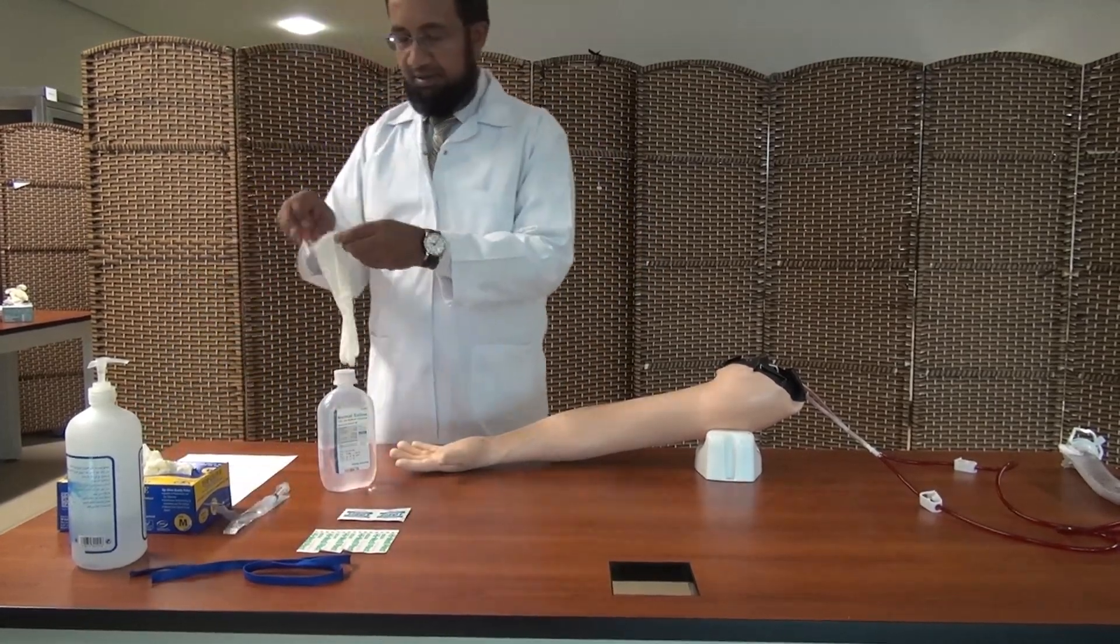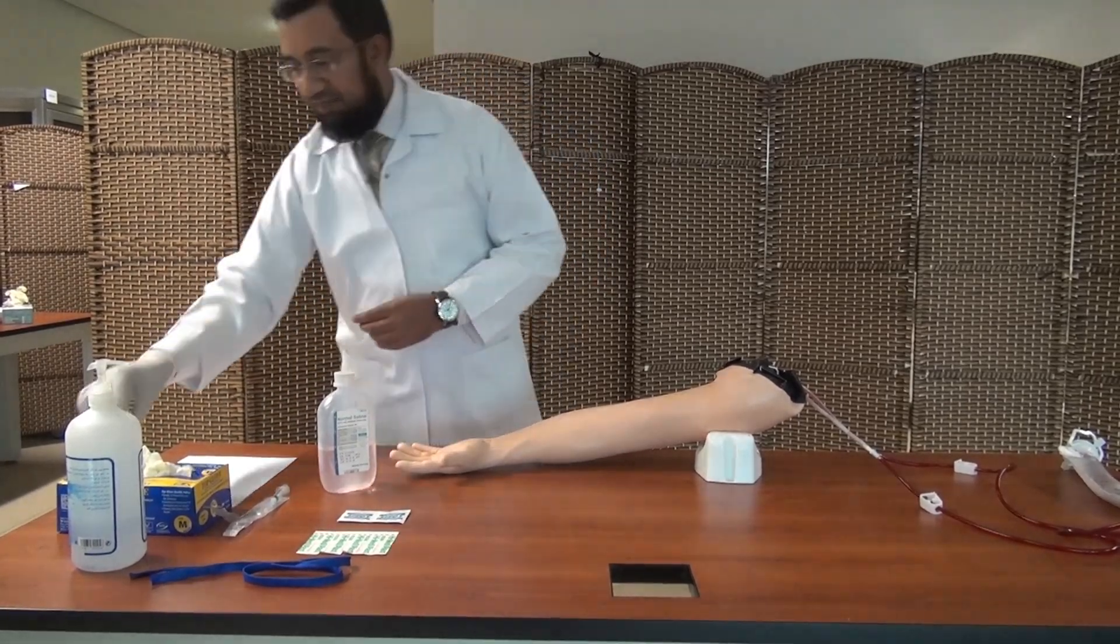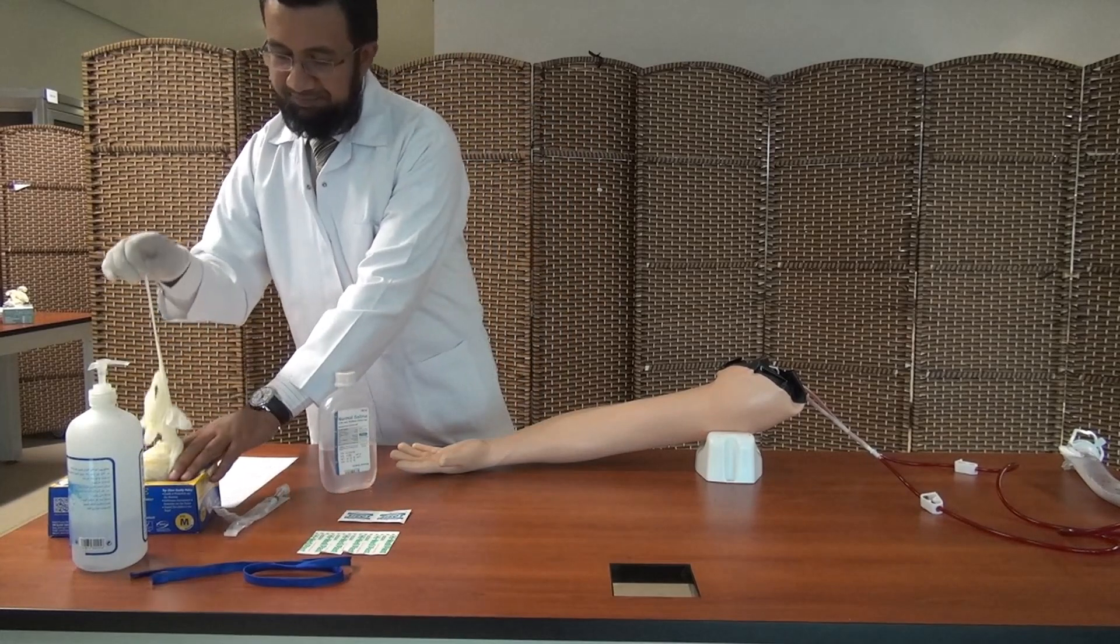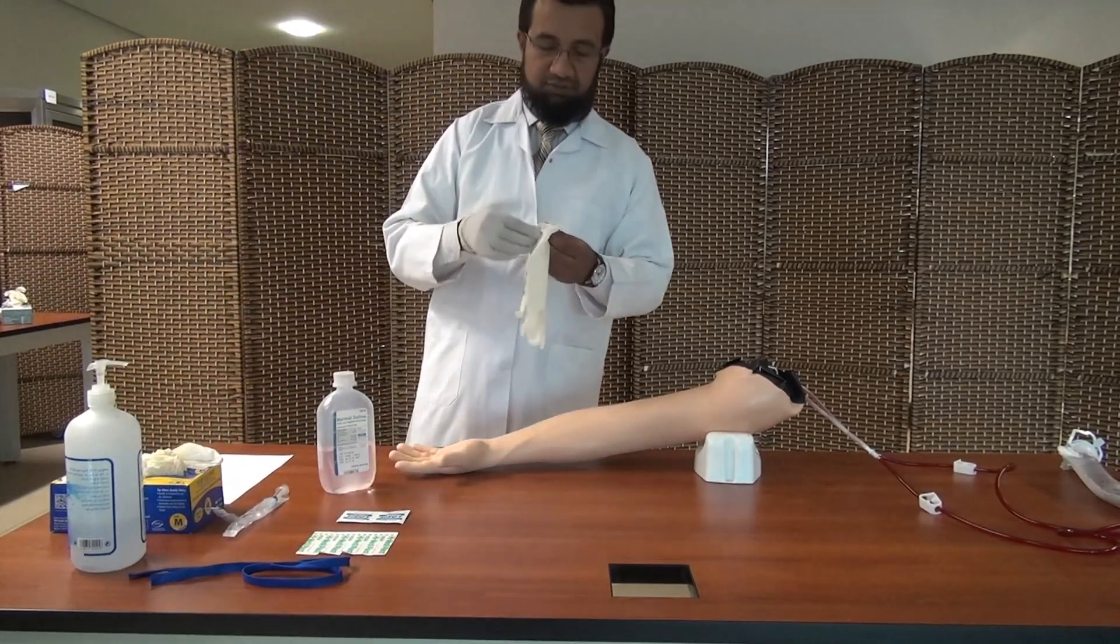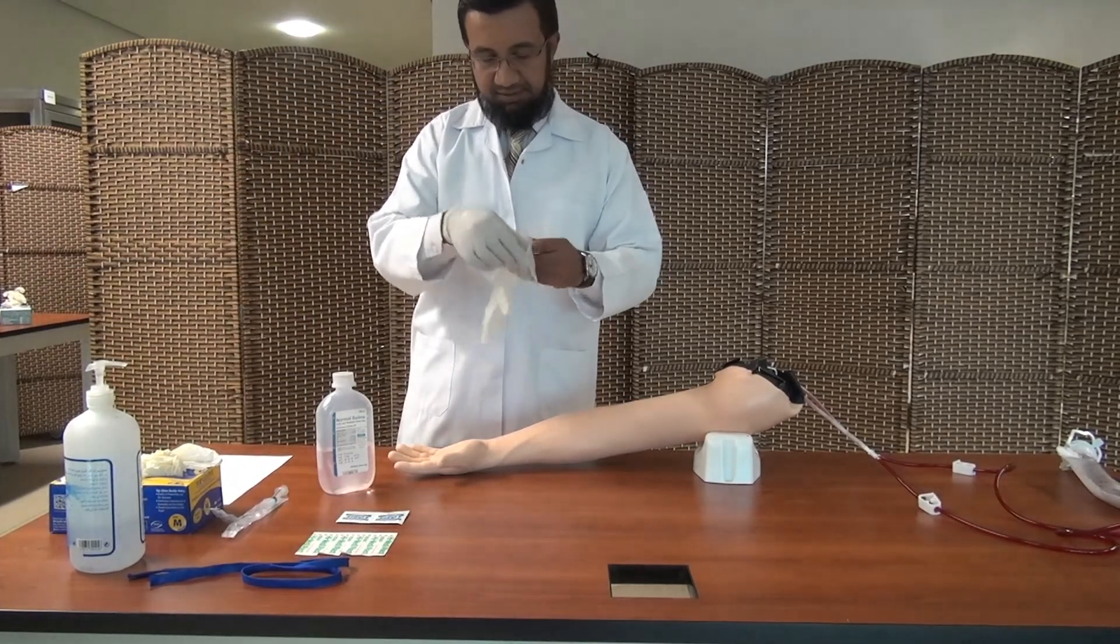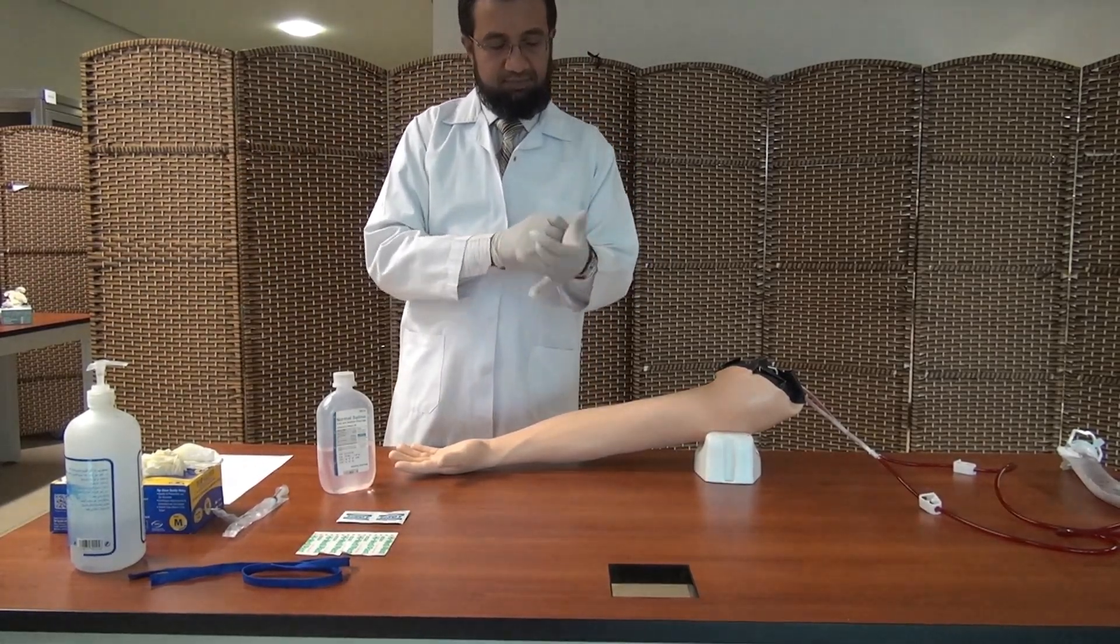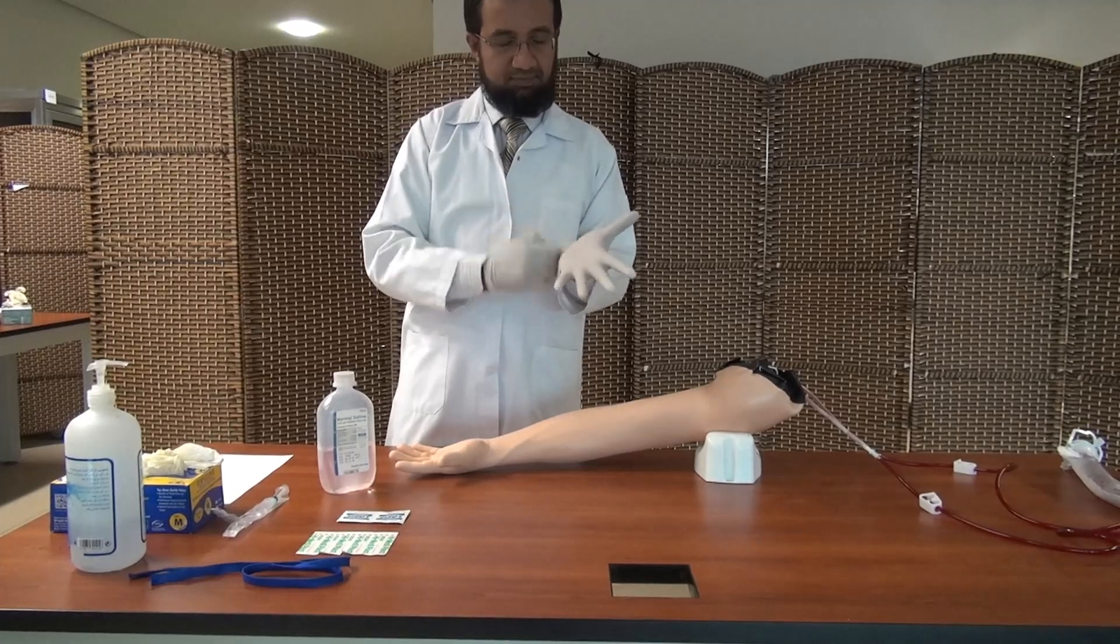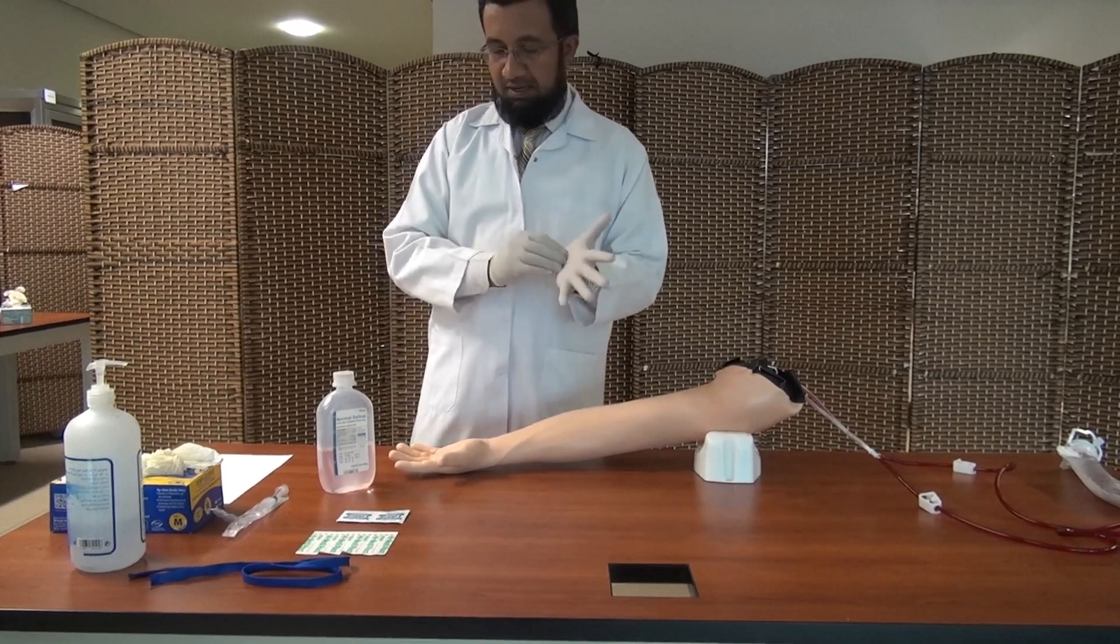Before you start, once you have sanitized your hands, it's always advisable that you wear gloves that fit your size of the hand.